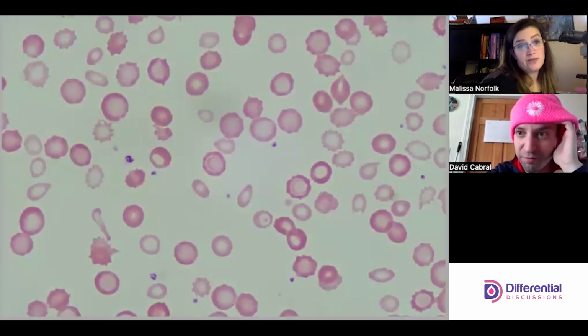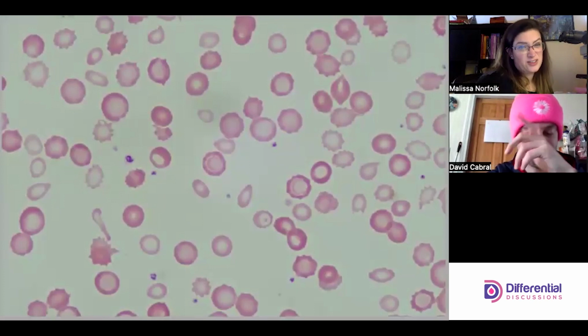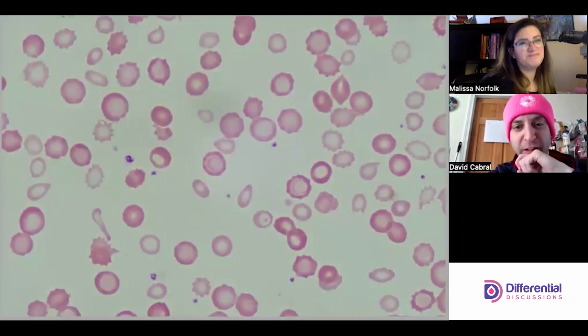Well, we actually have a video on uremia. So if people are more interested in learning more about uremia, we can link to that also. That's probably a fair point, rather than reinventing the wheel here. But what a neat slide though so far.